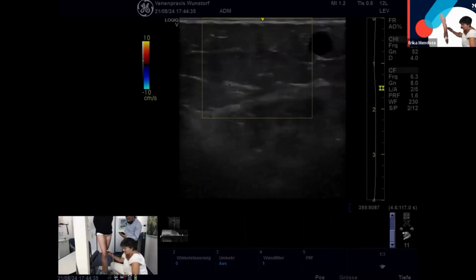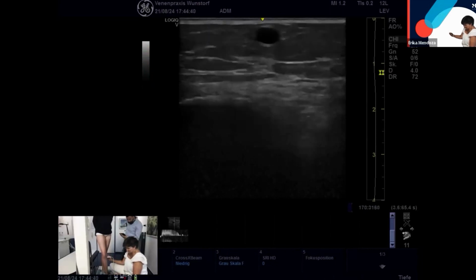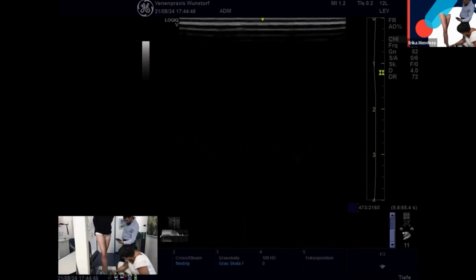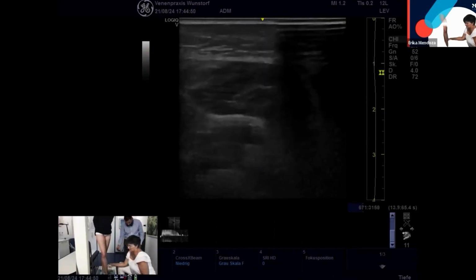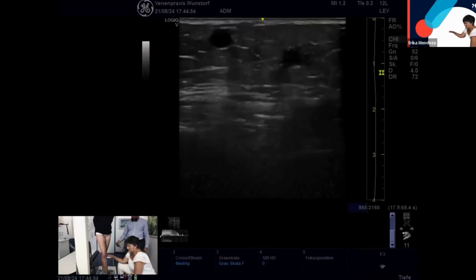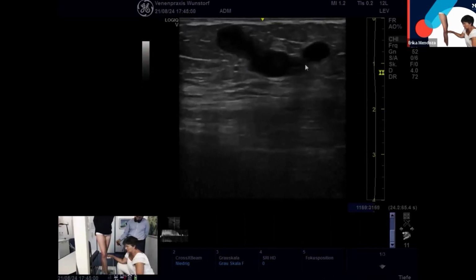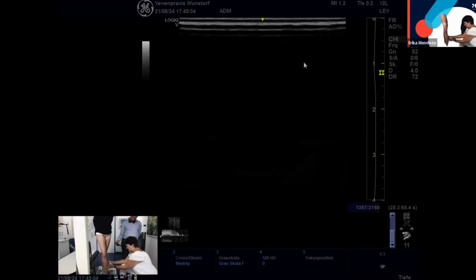So here we see the following. Here's a scar, and she has been stripped only until this level. But here we see that the vein, again a tributary, goes inside the fascia and out again. It makes like a little keeper. And then you have all these veins.